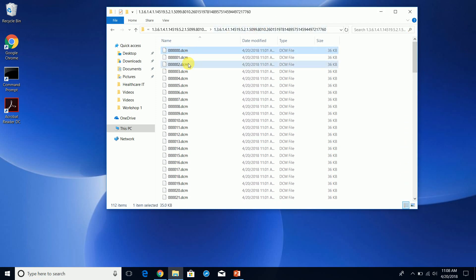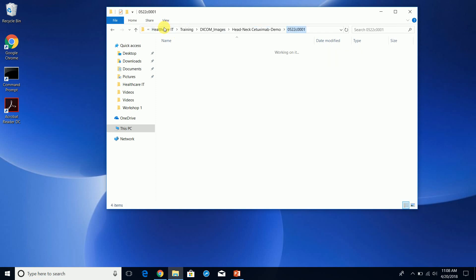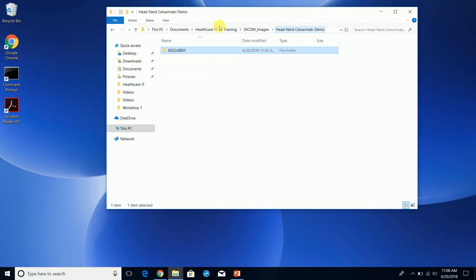Now you can see the actual images. This is a quick overview of how you can download test DICOM images. You can go back to the website and download additional studies as much as you want for testing. Next, we're going to be working with uploading these images into your DICOM server, and we'll also be playing around with these studies and images.